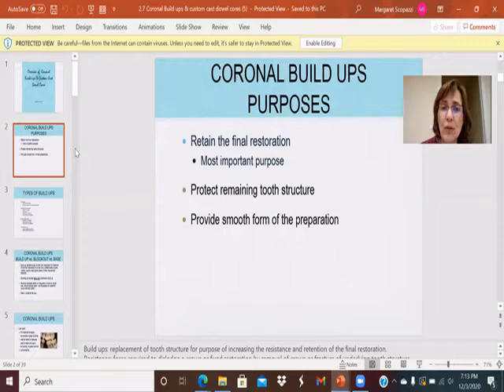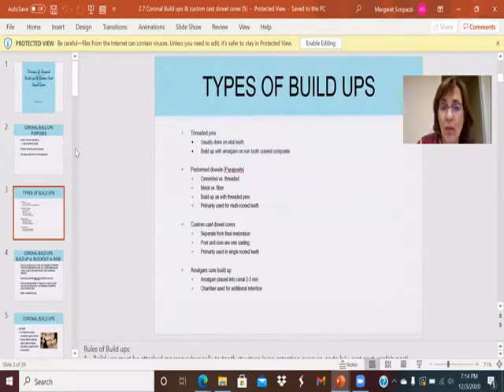First of all, we needed to do a coronal buildup because we needed to retain the final restoration — the crown — to the tooth. We needed to protect the remaining tooth structure; at this point we probably have three quarters or five eighths of the tooth left, meaning a significant amount of tooth was missing. And we needed to provide a smooth preparation so that when we take the impression to send to the lab, there are no undercuts, and the lab can clearly see the edges of the crown and what type of restoration is needed.